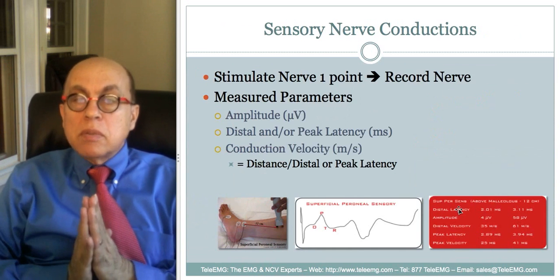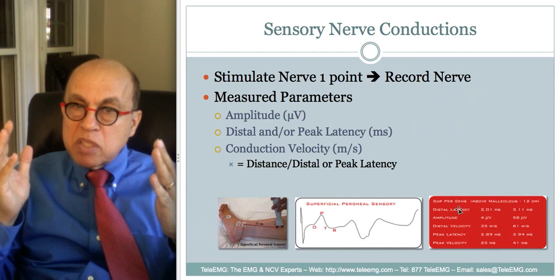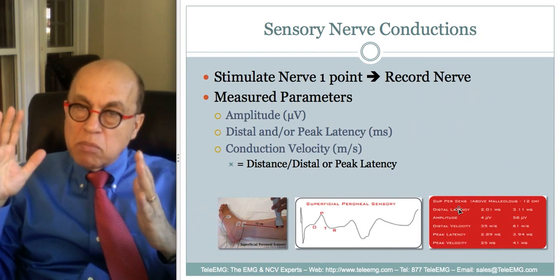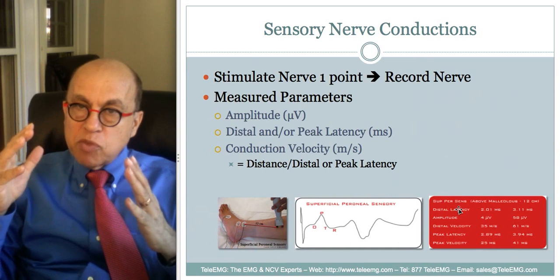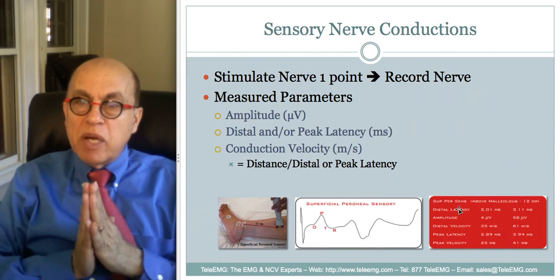So, now we're going to come to the lower extremity. The principles of sensory and motors are the same. They also have F responses, but in addition, they have the H-Reflex, and I'll tell you a bit more about it.